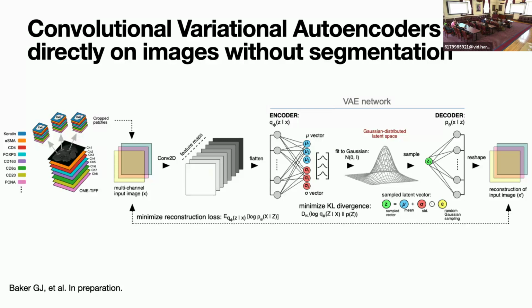It's also weighted by a Gaussian window so that the center of the cell is weighted strongly, and the edges of the cell and its contacts with neighbors, which may have been captured in that square vignette, are suppressed. So we're only learning in this case things about the cell itself and not its neighbors. This is fed through a variational autoencoder network, which learns basically to embed each cell in a Gaussian distributed latent space. In this case, I think they used an 850 dimensional space.